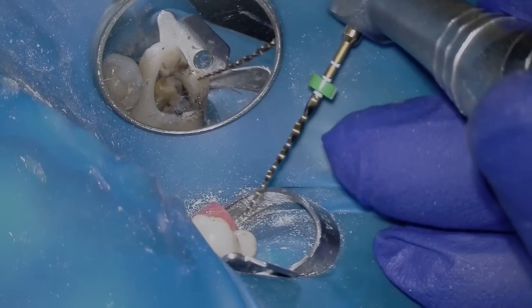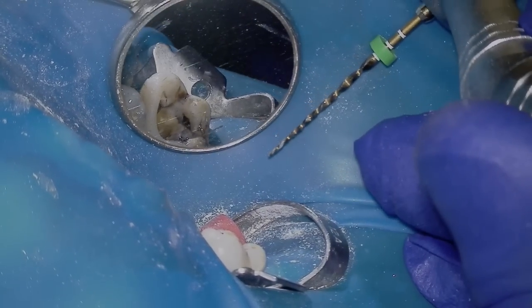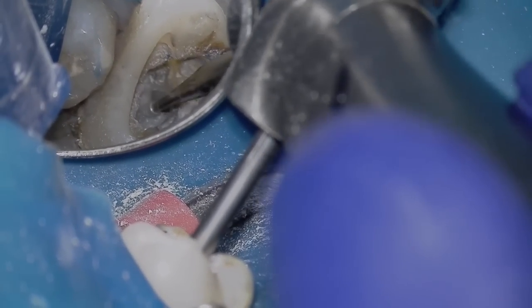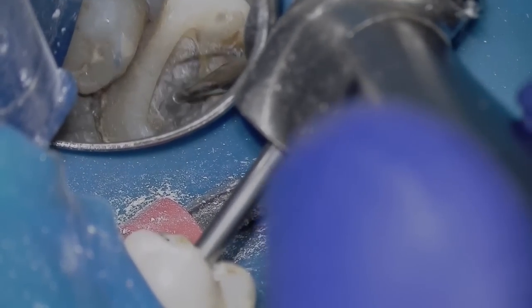I finish all my canals with a WaveOne Gold Medium minimum, and if the palatal canal for example is larger, I'll use a hand file to finish the apical third. Now I've done cleaning and shaping, and I'm going to use a slow round burr number two in my electric handpiece to trough and remove more of that calcification just to look for MB2.